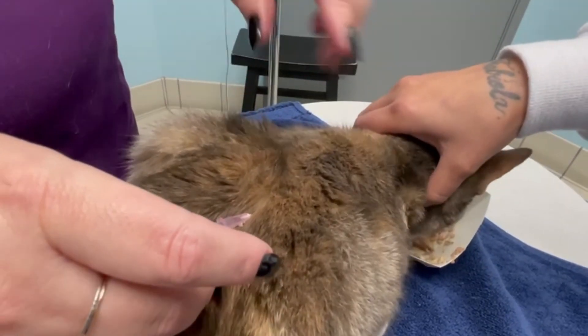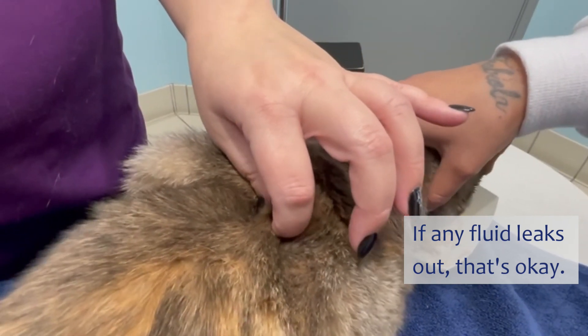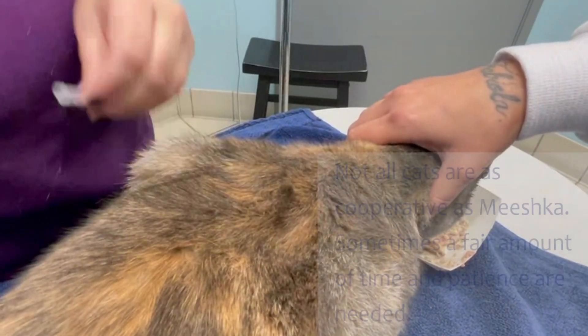After you're done giving the fluids, make sure that you pinch where you're taking the needle out. A little bit of fluid or a little bit of blood might leak out, but that's fine.